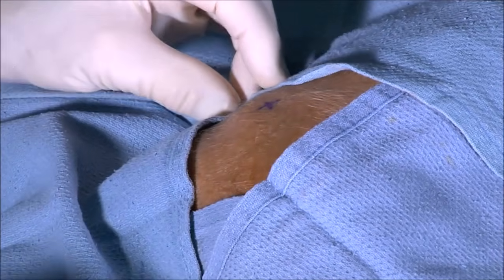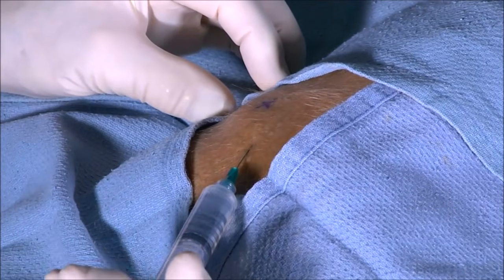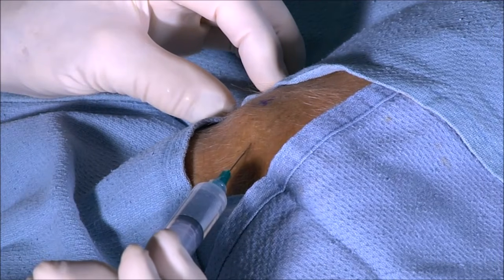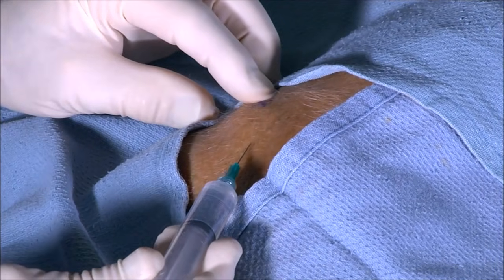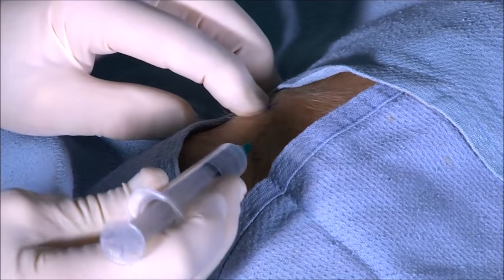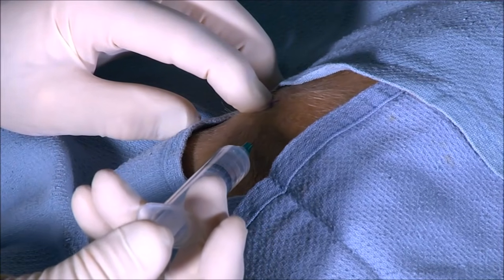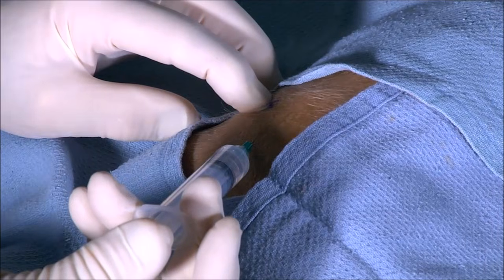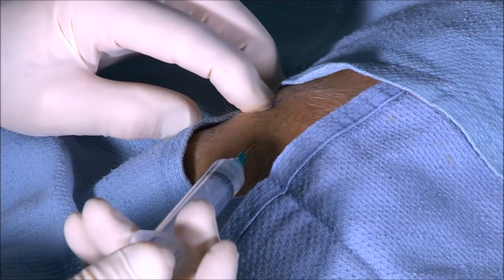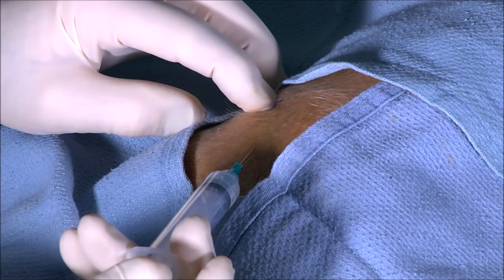You'll feel a little stick and a little bit of discomfort. Sorry. First, you make a skin wheal because that's a painful area. And then go ahead and advance the needle down through the fascia to the point where you're feeling the bone. You should be able to tap on the bone, and you may feel a little discomfort here. We're injecting approximately 2 to 3 cc's of 1% fast-acting local anesthetic. And then we're anesthetizing the tract.